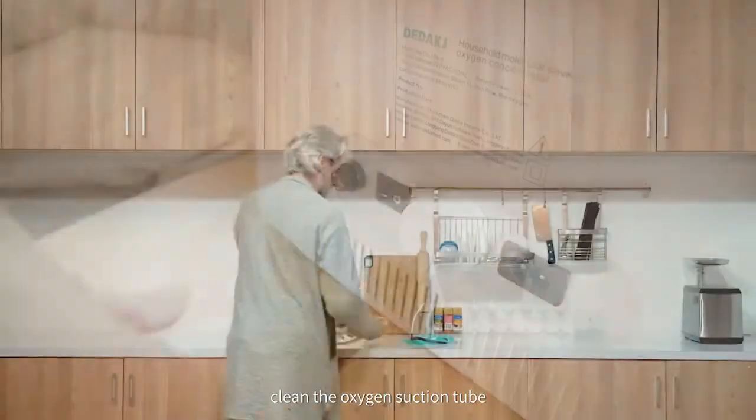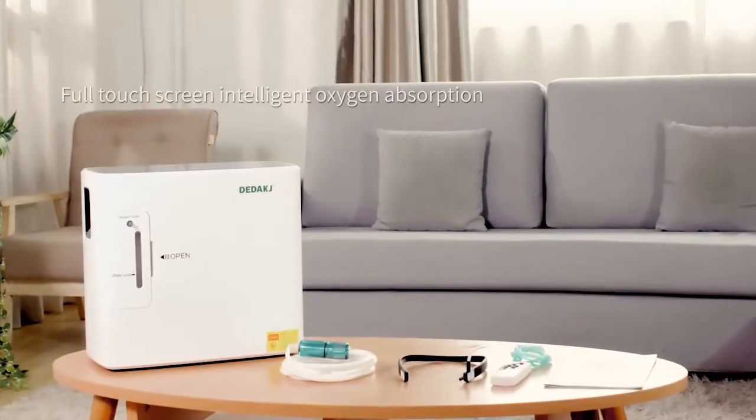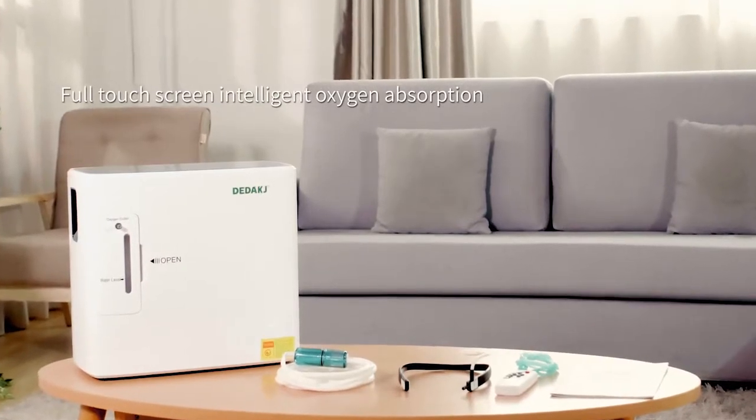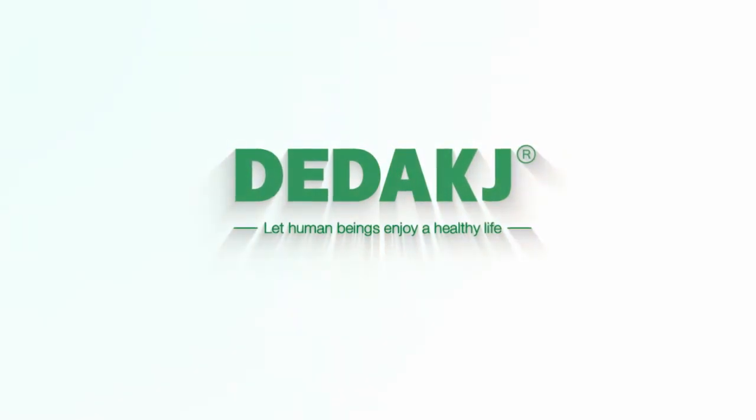Then, turn off the power switch. Clean the oxygen suction tube to prevent dust, and store properly.